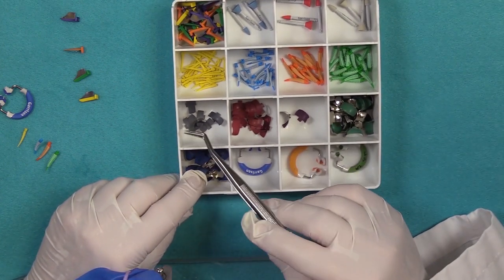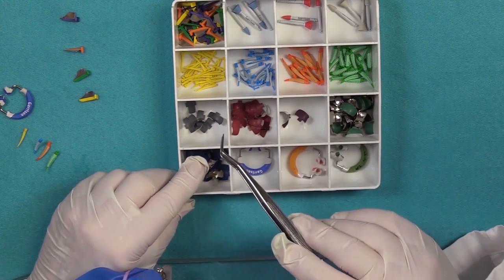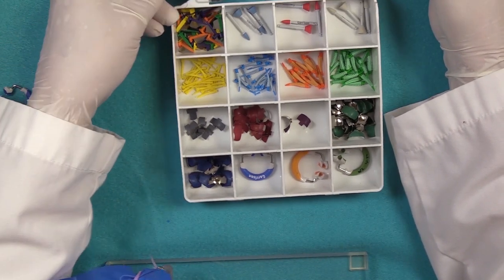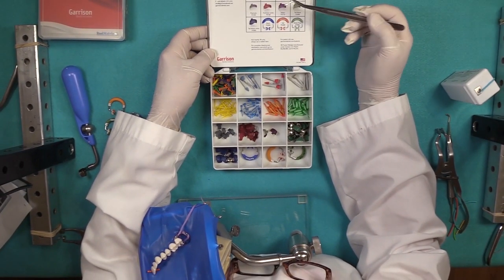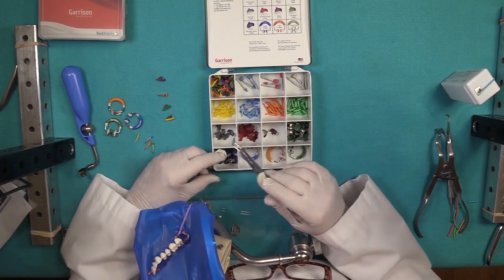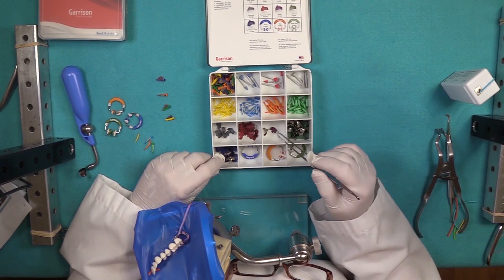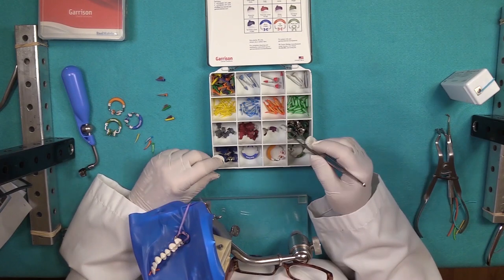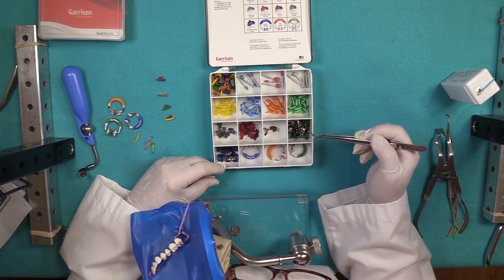We have our contoured matrix systems here. You'll notice that they're according to size. As a little guideline, it shows you that you have the smaller one for premolar, then you have a premolar with a subgingival section, then you have a molar, and then the tall molar as well. It depends on what size your tooth is that you're restoring — really more of an issue of sizing.